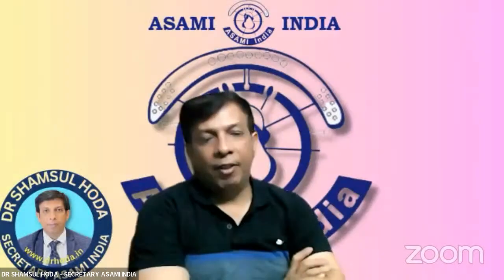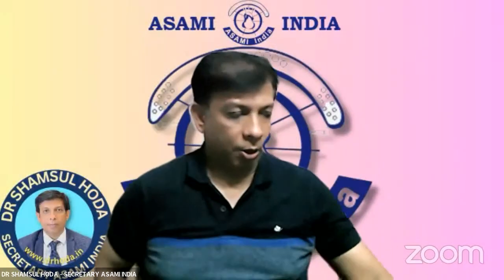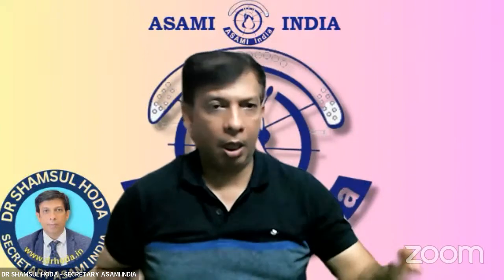The fixator removal is done most of the times in a phasic manner, on an outpatient basis. Except in children, it is removed in the clinic itself. So what is the average duration of the ring on, sir? How many months do you keep the rings on, on average? Sir answered 6 to 8 months, roughly.